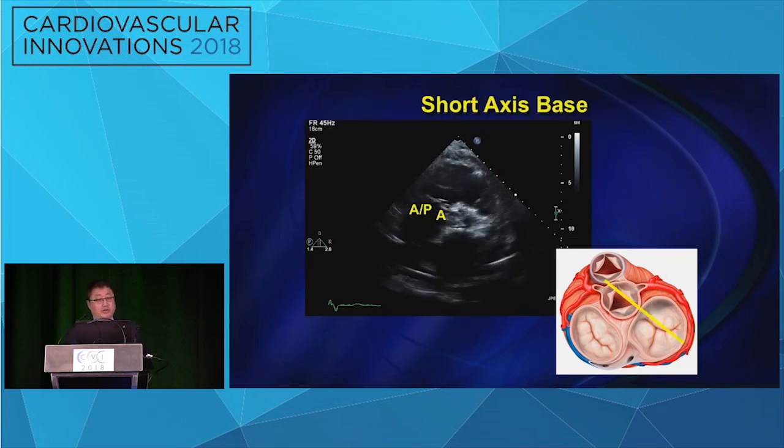And this is a very important view, both by transthoracic and by TEE: the short axis view. I would say it's analogous to the commissural view for MitraClip. As mentioned before, if you're close to the aortic valve, you're going to be looking where the anterior and septal leaflets would be, and as you move more laterally, you eventually get into more of a posterior.